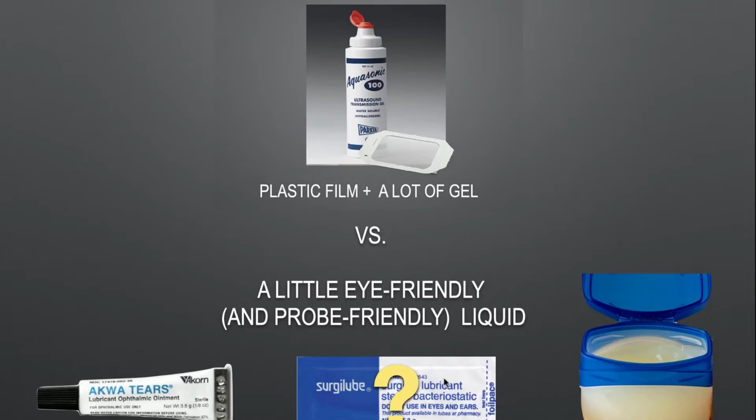Surgilube is mostly eye-friendly materials, but our particular Surgilube packets have chlorhexidine in them. So does our big bottle of gel, actually, so using this isn't any better. These small packets are usable and is probably what I'd still use in most patient cases, but please try to keep it out of the patient's eyes. And I usually try to wash it off with a wet washcloth afterwards to try to minimize how much they get into their eyes.